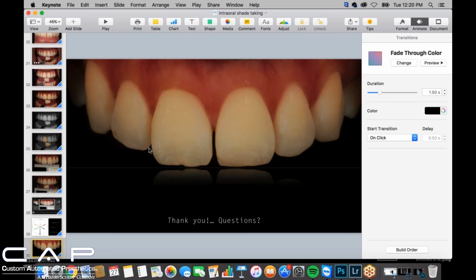A lot of patients find it kind of irritating that they have to take these retractors in and out, but if I'm spending 10 to 20 minutes or even longer with a patient to get this shade, the last thing I want is for them to sit there with their lips retracted, mouth breathing for half an hour, because it will make a big difference. So definitely get your patient to close their mouth and rehydrate as needed.